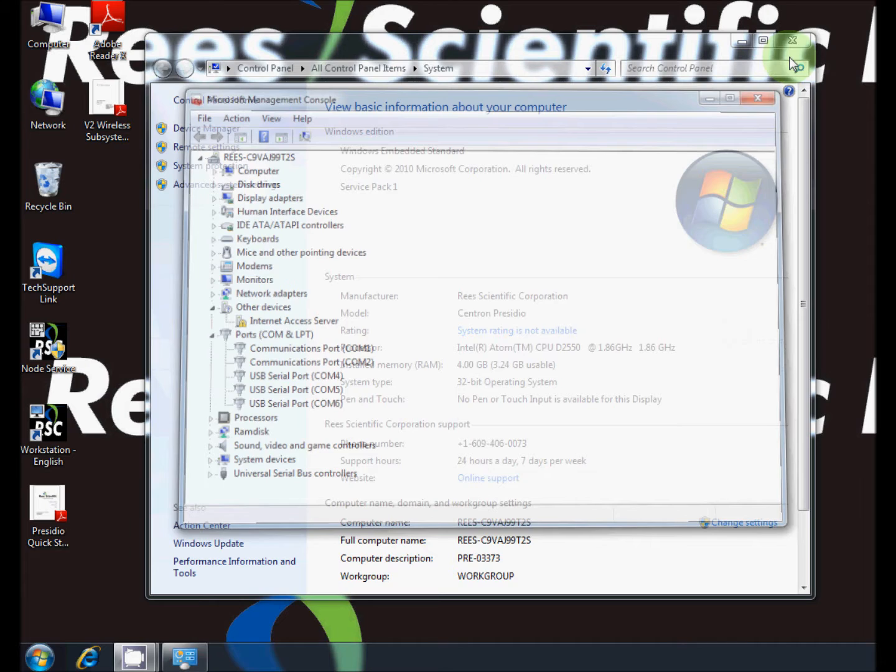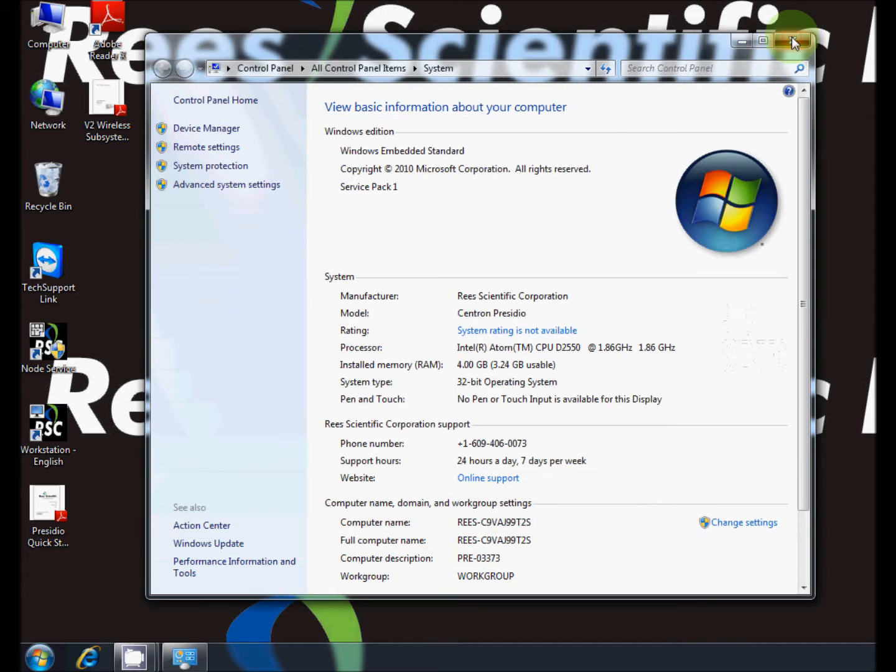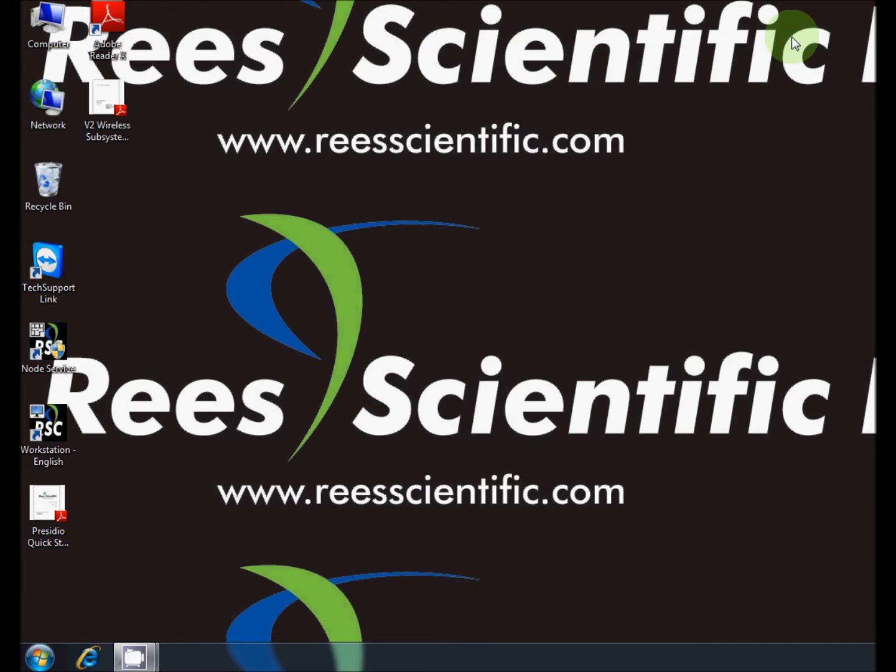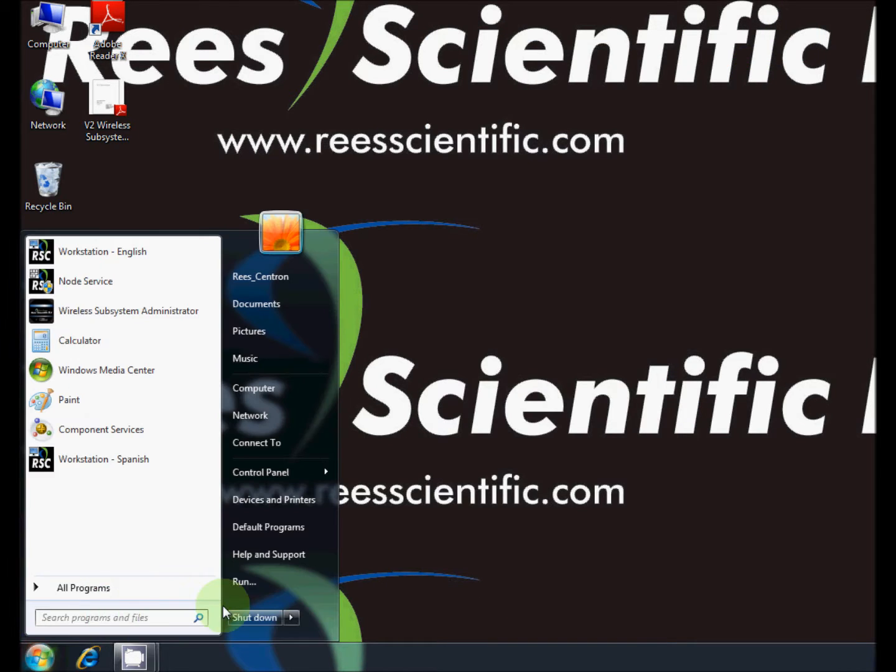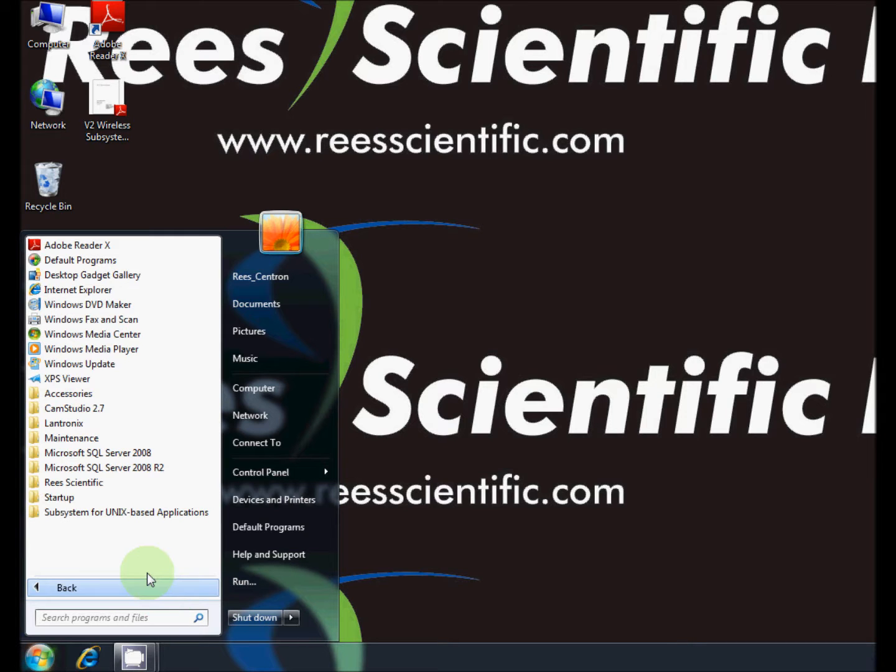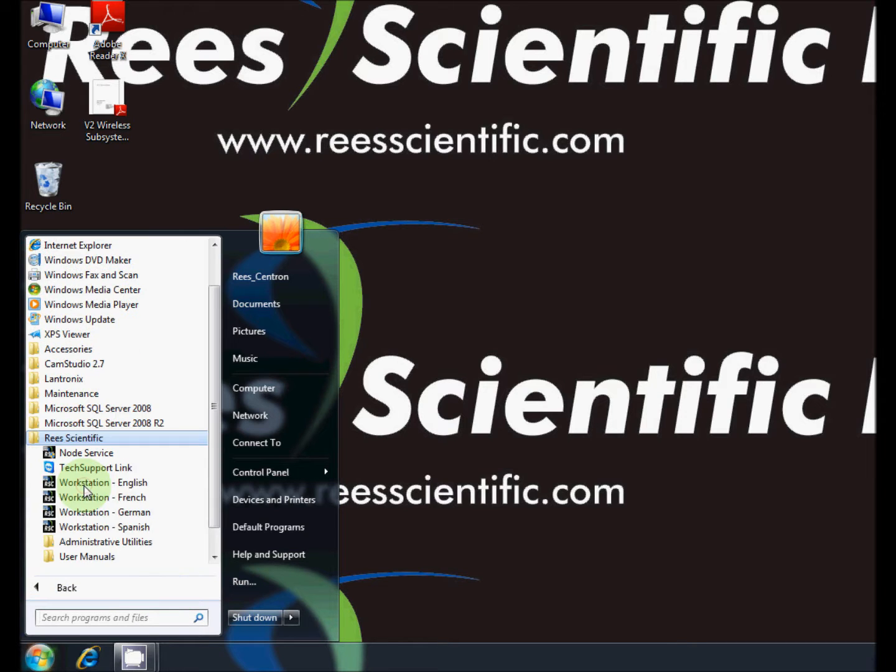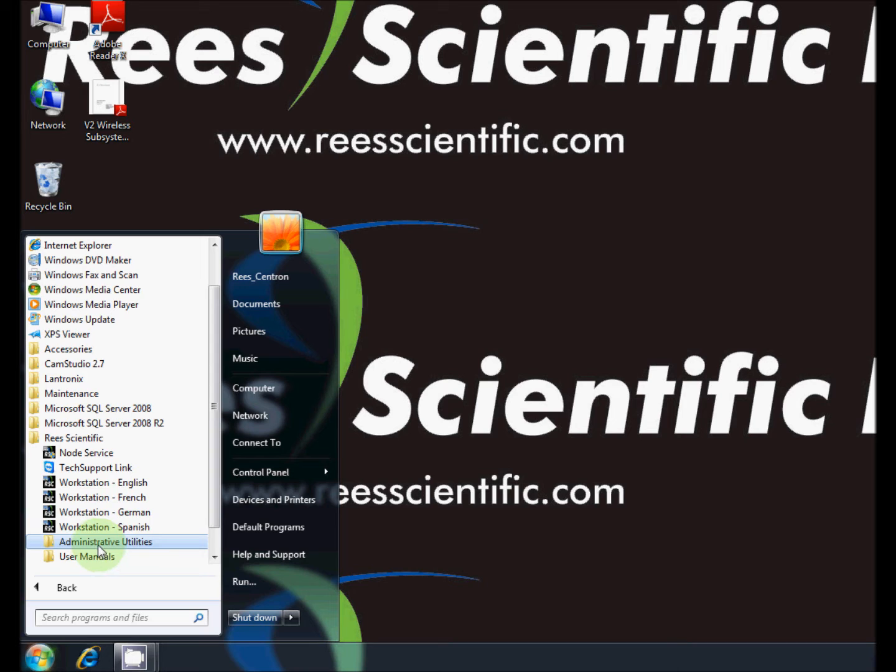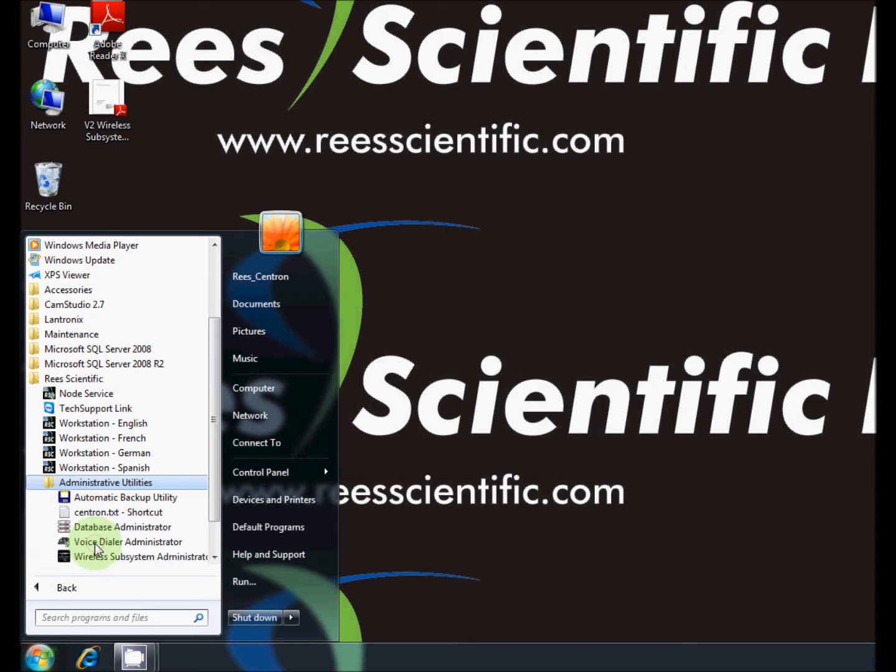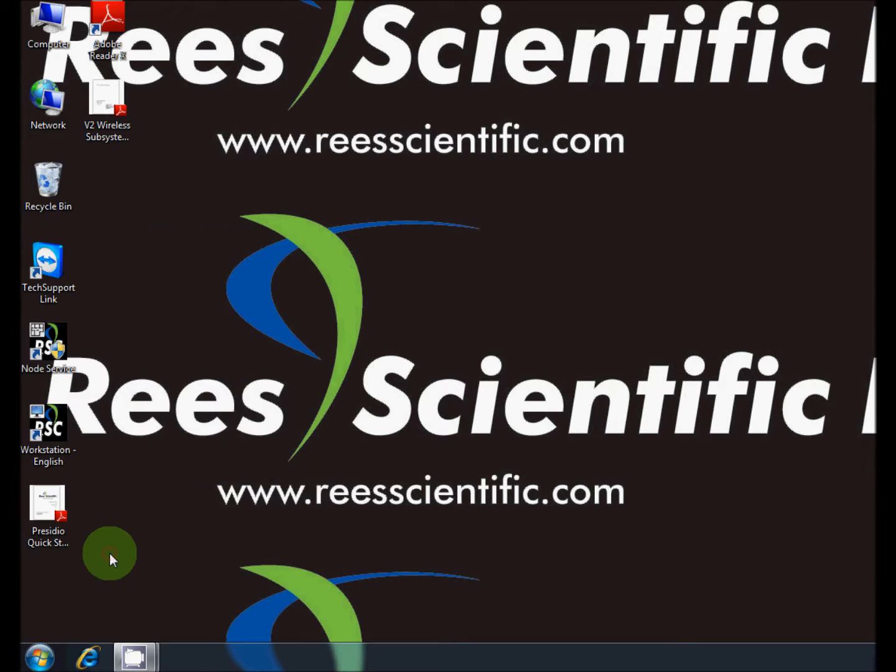Now close all windows and open Test Wireless. This can be accessed by clicking on the Start menu, All Programs, the ReScientific folder, Administrative Utilities folder, and finally Wireless Subsystem Administrator.